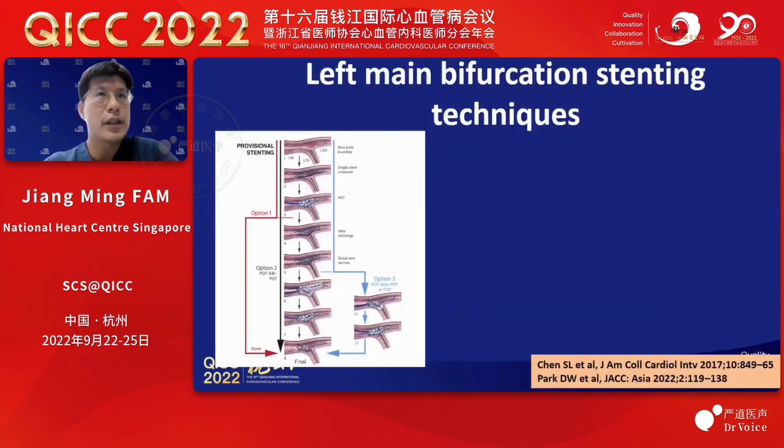Provisional stenting with a single stent technique consists of stenting the main branch, mainly with the diameter selected according to the diameter of the LAD. Now, if intervention is required to the ostium of the side branch, guide wire exchange is performed, preferably with distal recross with the main branch wire or a new wire. Kissing balloon is then carried out with two short, preferably non-compliant balloons, with the side branch balloon minimally extending beyond the ostium, and POT is then performed with final result.